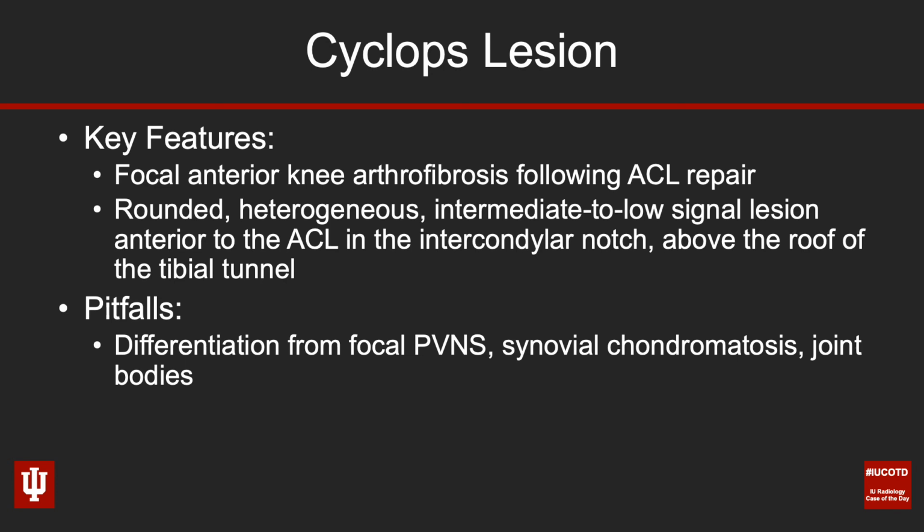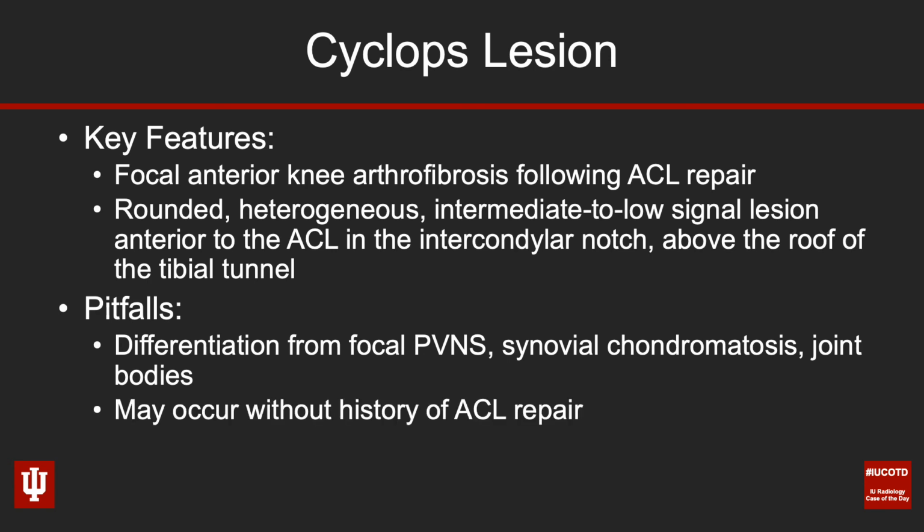Pitfalls include differentiation from focal PVNS, in which the patient history of ACL repair and cyclops syndrome would be strong differentiators, as well as synovial chondromatosis and joint bodies. Rare instances of cyclops lesions occurring without a history of ACL repair may be reflective of a shared pathophysiologic origin.